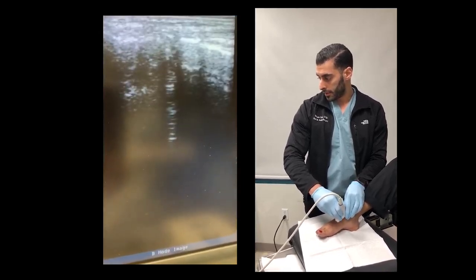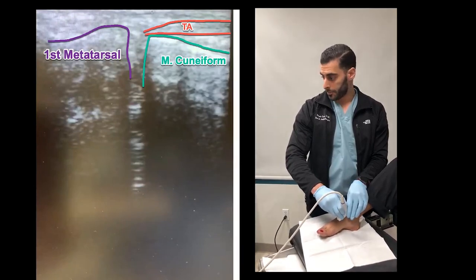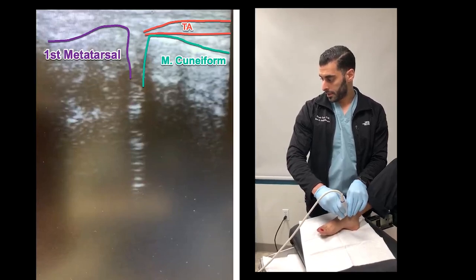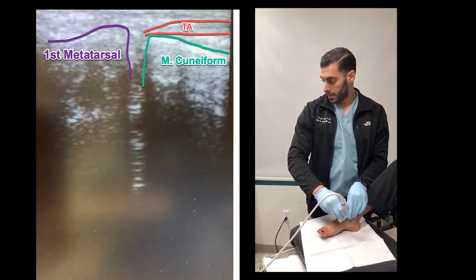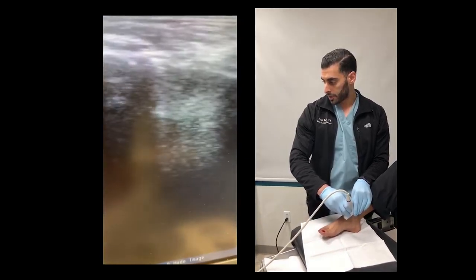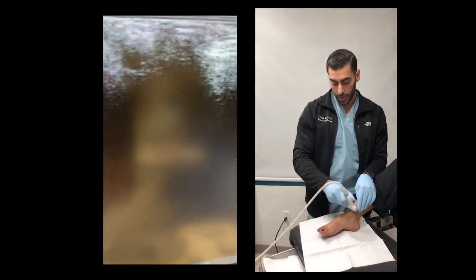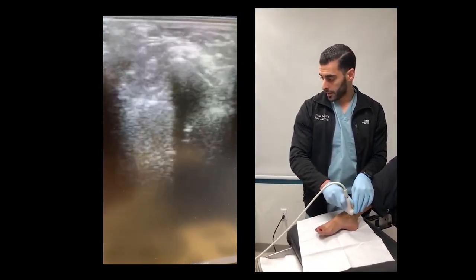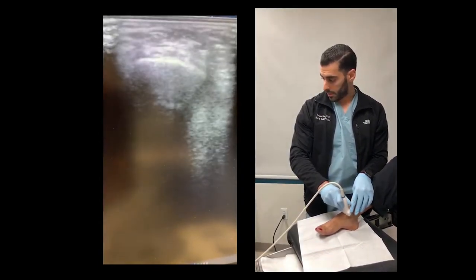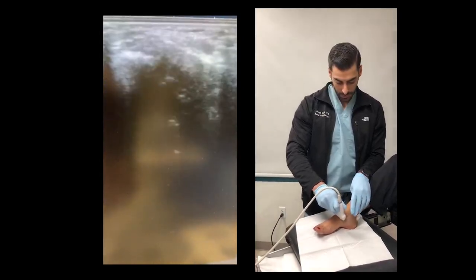So right there, I can see it inserting into the cuneiform. Okay, and then you can trace it back just to make sure you didn't miss anything, and even go in through the axial and trace your tendon all the way to the insertion.